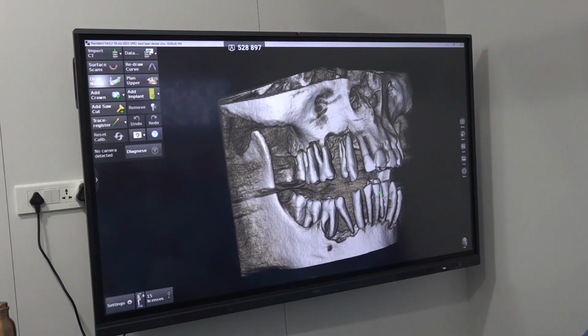If you carefully observe, the right tilted implant was going through the sinus and then it is catching. So when I was bending, there was a little shake. Some movement inside the bone happened, but that is okay. Once you connect everything, there won't be any issue for D3 or D4 bone.